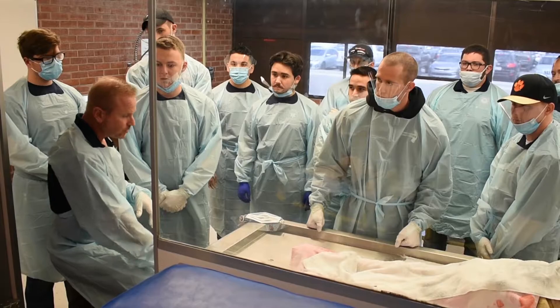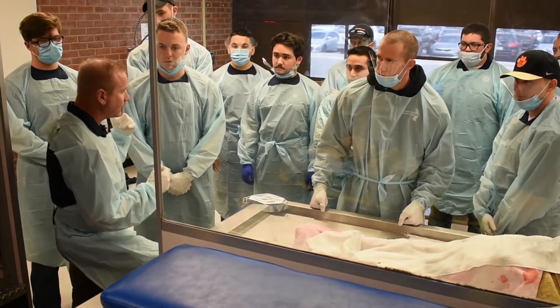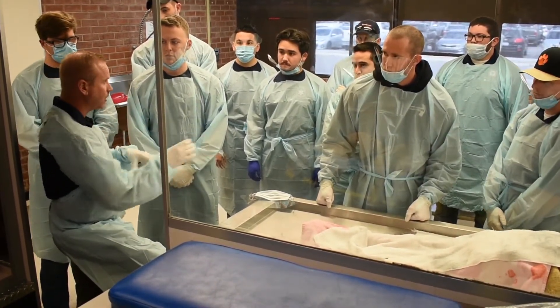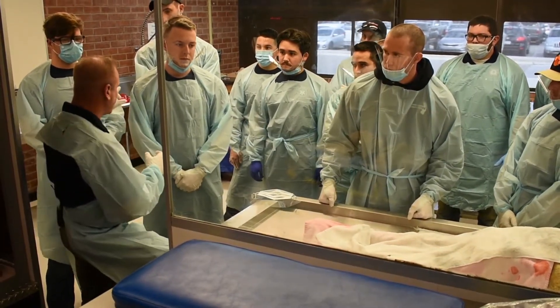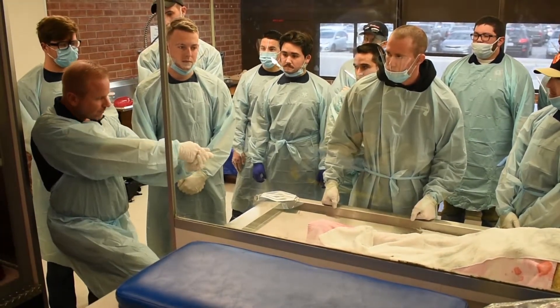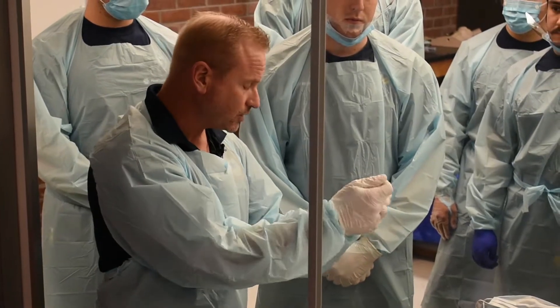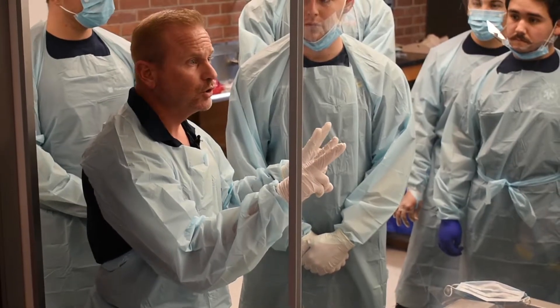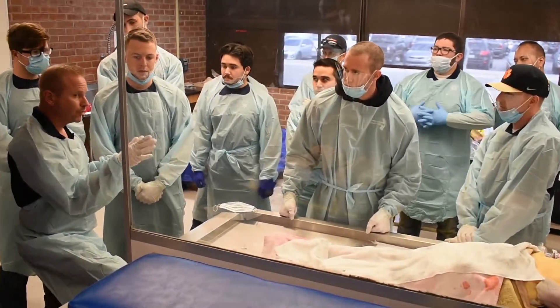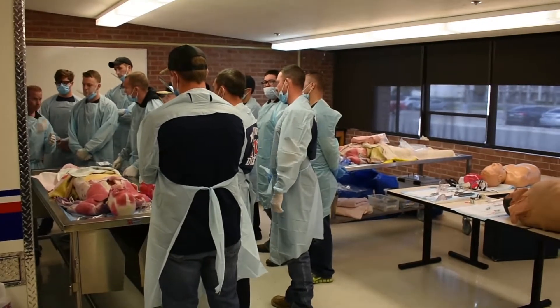We'll show you the technique with the rigid stylet so you don't have to bend the tube — those stylets don't bend. We will have open sharps, so please be careful. We're going to be going at a fast pace, but slow is smooth and smooth is fast. I don't want anybody poked with the needle crike. Don't separate the needle from the catheter all the way or some of them will lock out. Groups of two — pair up, everybody should have a station. Both Sue and Tara will be walking around giving you guidance, and Tara is our timekeeper — we're right on time.